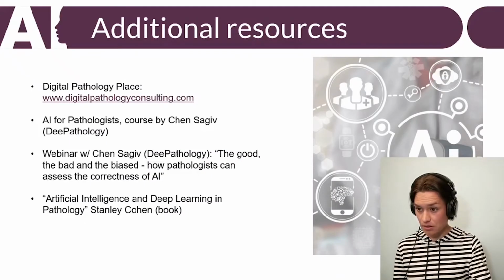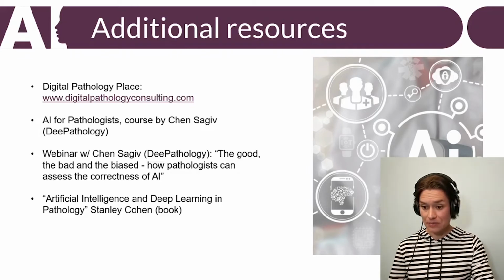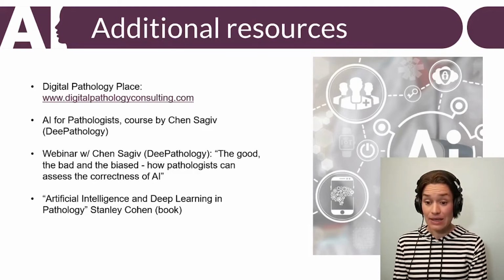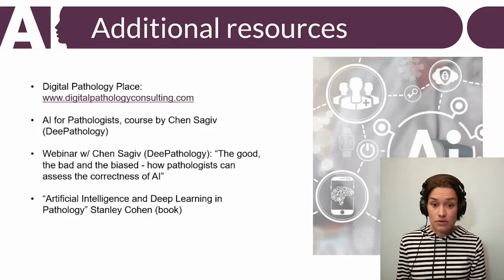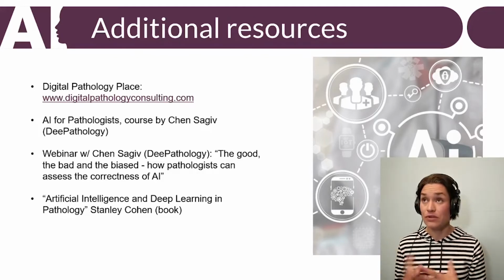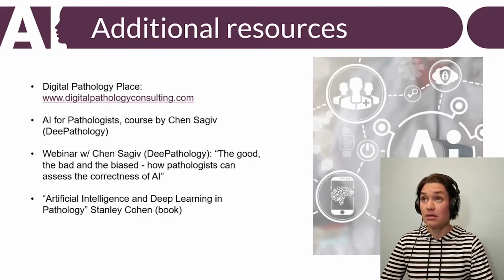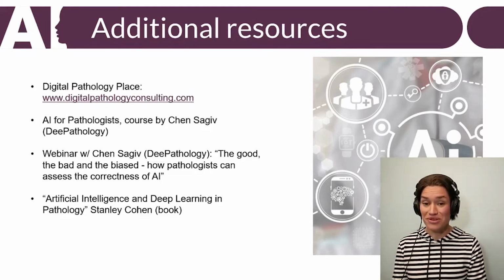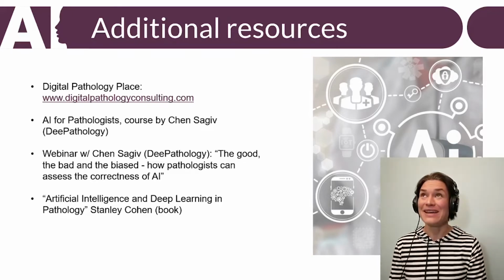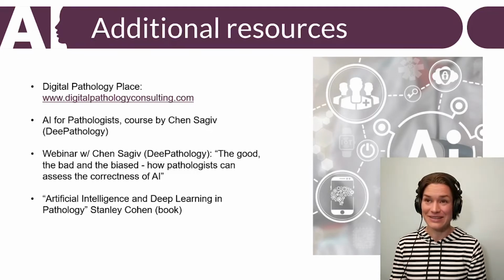I think that's it. And what would be the acceptable sensitivity and specificity for AI? This is like for any test. Your intended use decides what your metrics are. Sometimes you can optimize for one metric and the other one can be just 50-50. For a screening test, and now I'm going to my acronym again: sensitivity to rule out, and specificity to rule in, for a diagnostic. So for a screening test, you optimize for sensitivity.